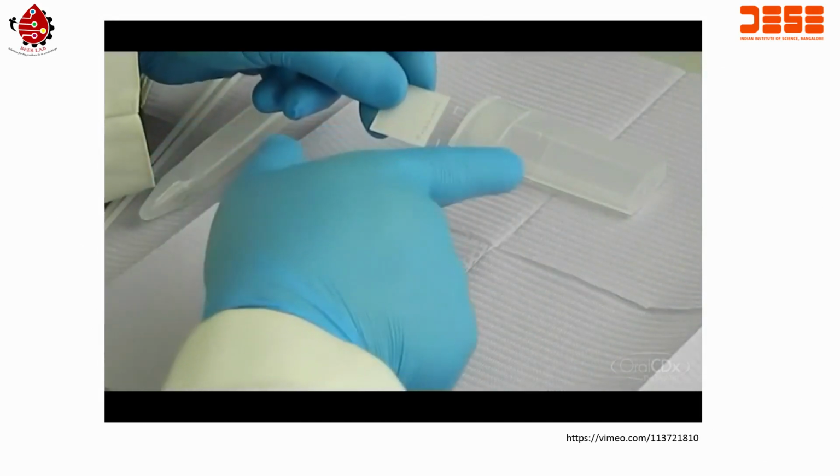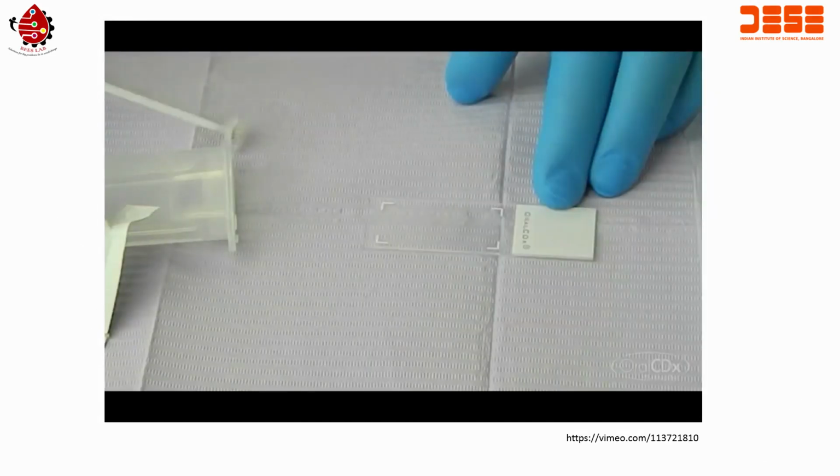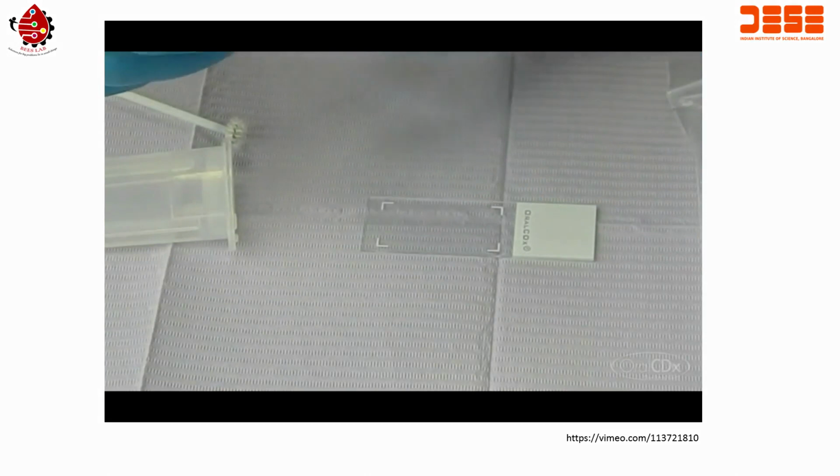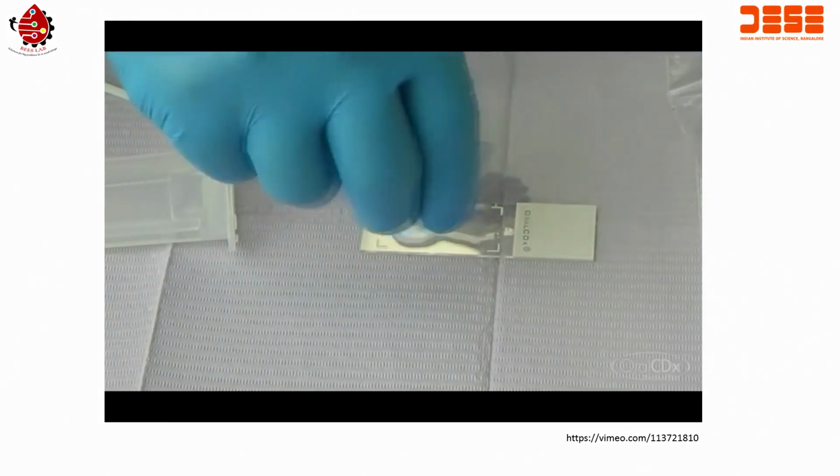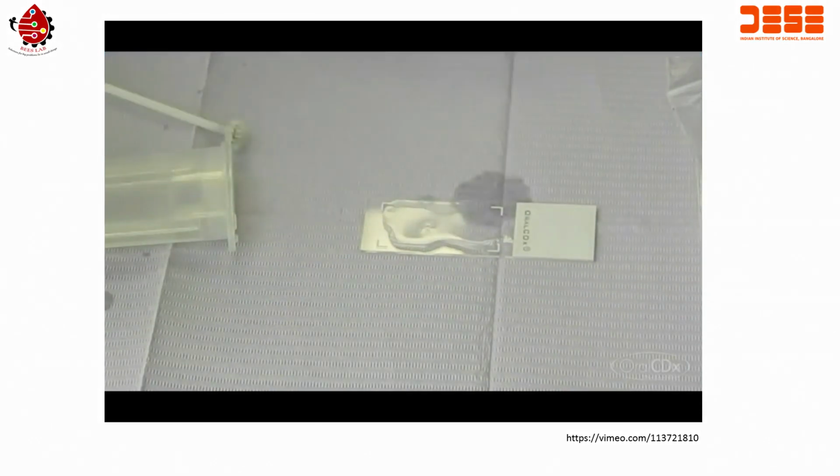while remaining within the bracketed area. Once the transfer to the slide is complete, immediately fold the fixative pouch in half and squeeze the contents over the slide, flooding the specimen. Any delay may result in air drying of the specimen, which compromises the quality of the cells.